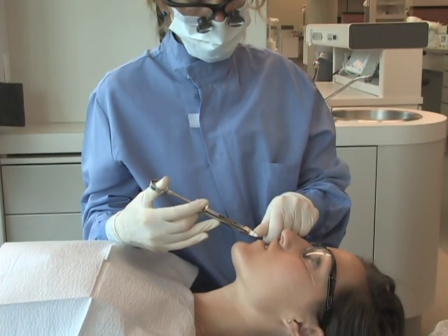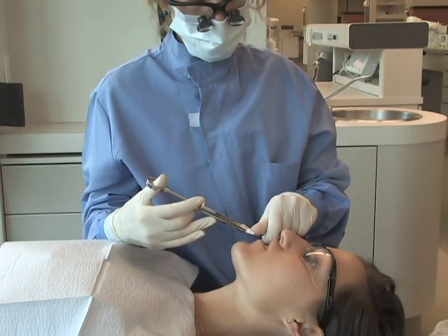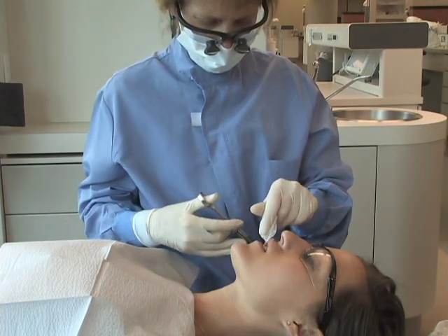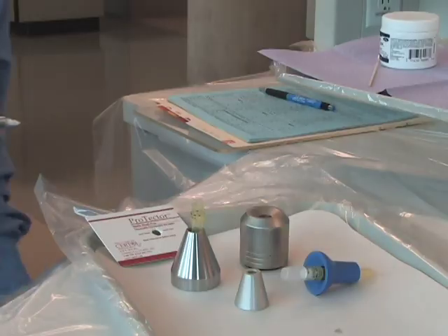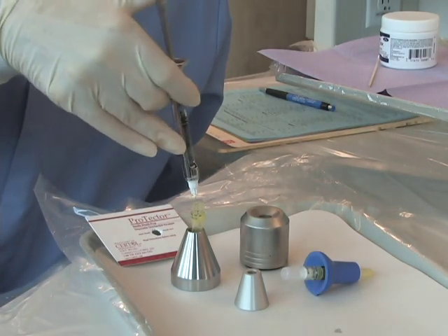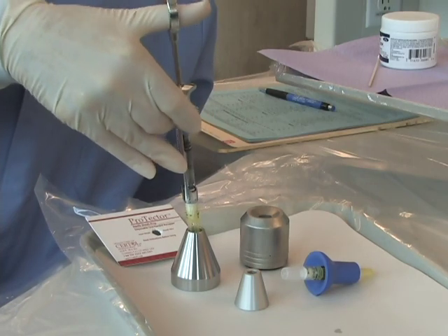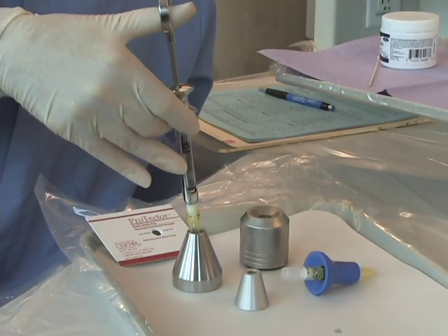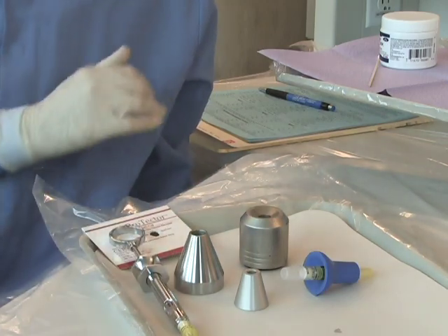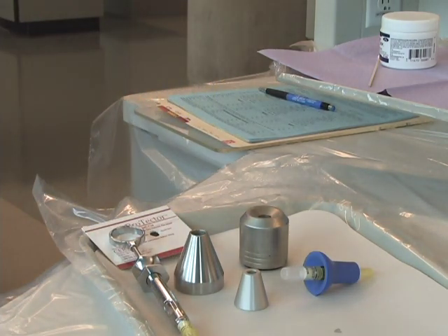Finally, withdraw the needle slowly from the tissue and make the needle safe using an accepted recapping technique. A variety of commercial needle guards are available for health care professionals. Needles must not be recapped without using one of the many protective barrier devices. It is permissible to use a one-handed scoop technique to replace the needle sheath.